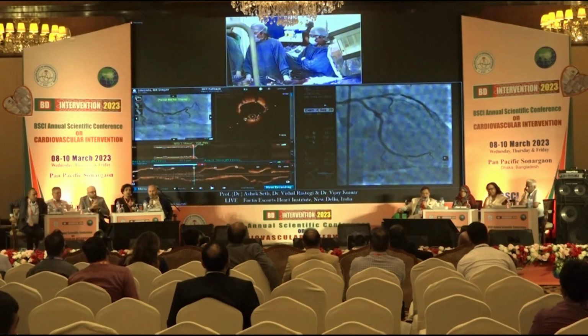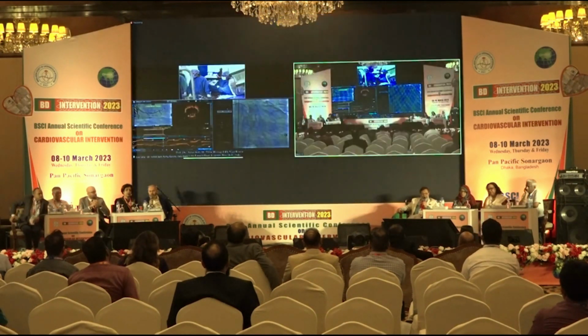So how does it look, Nishit? Yes, sir, we are hearing you. Oh, good, good. So yes, it's well expanded. Now Nishit is going to actually talk to you about the OCT.